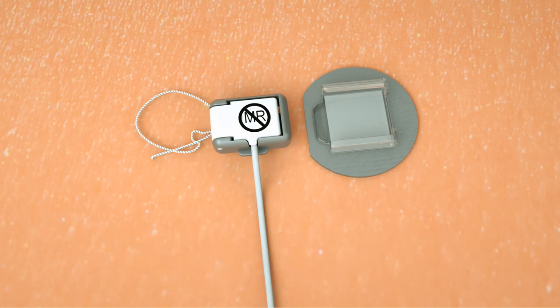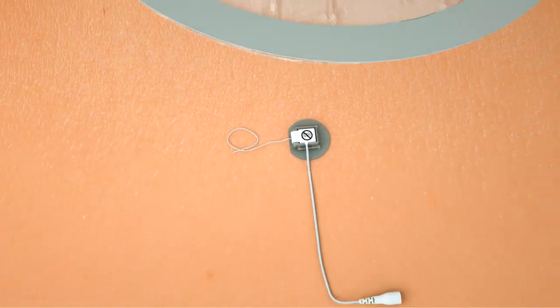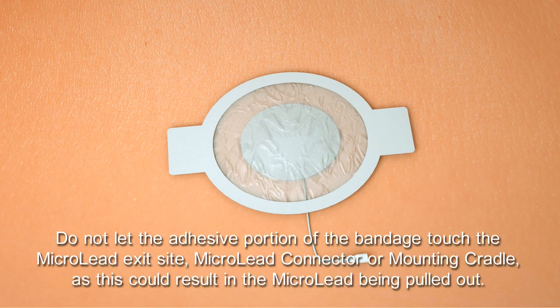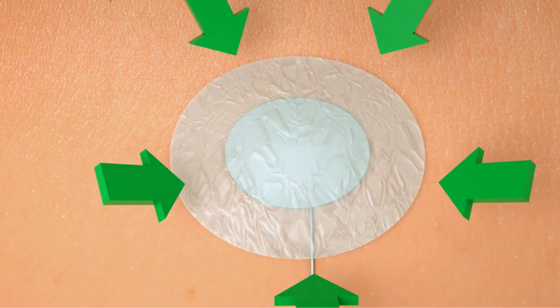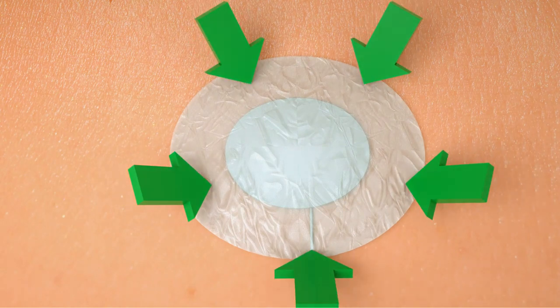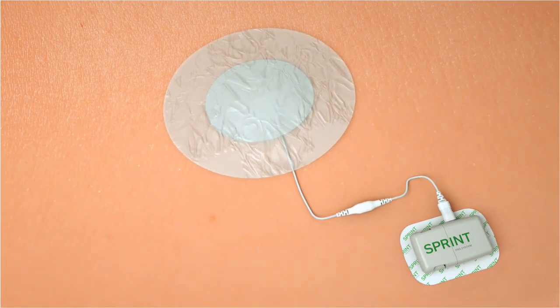Slide the MicroLead connector onto the new cradle. Place a new waterproof bandage over the MicroLead exit site. Do not let the adhesive portion of the bandage touch the MicroLead exit site, connector, or mounting cradle, as this could result in the MicroLead being pulled out. Press the adhesive edges of the bandage firmly onto your skin. The cable extending from the MicroLead connector will pass under the edge of the bandage.